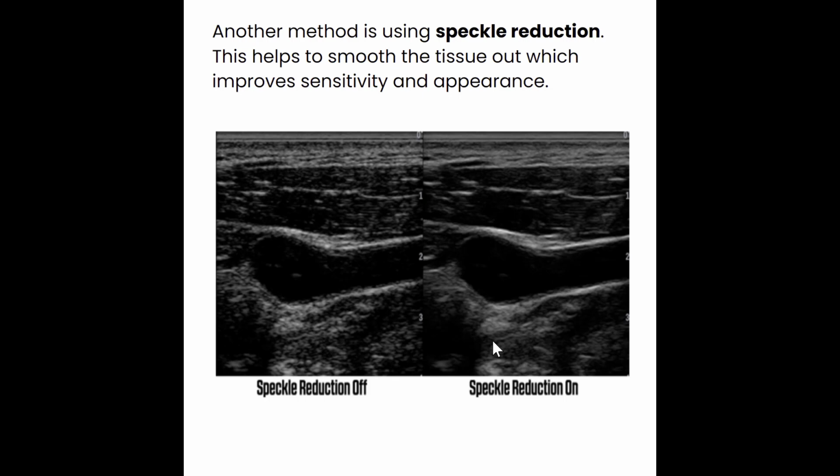They're actually very smooth. Remember, all of these borders, all of these textures that we're seeing are all due to interference, which causes the speckle. So technically, speckle is an artifact because it is not truly representing the smoothness or the texture of the organs, but it does represent the texture of the tissue as we know it by ultrasound.